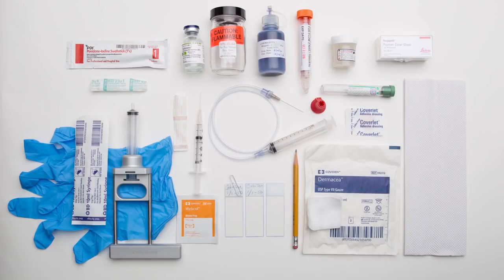Many of these items are standard. Additional helpful tools are tubing allowing application of suction with the help of an assistant, RPMI medium for flow cytometry, a rubber top tube, and a rocket needle disposal safety device for anchoring the needle while expelling material trapped in the hub, stain for rapid on-site evaluation, and formalin for cell block fixation.